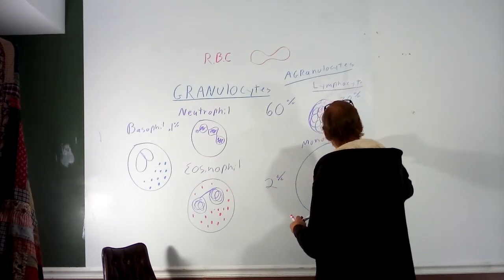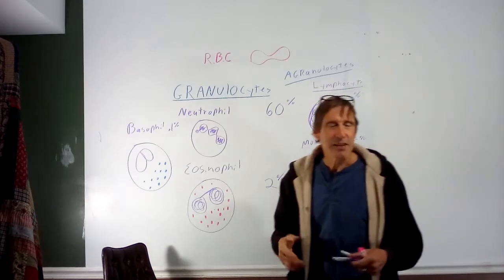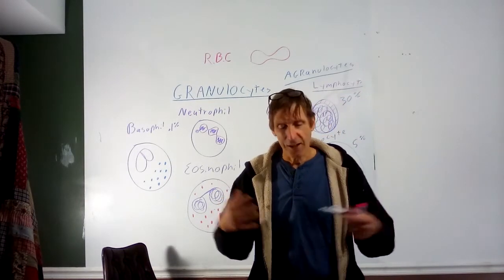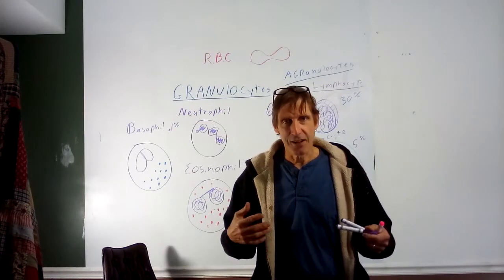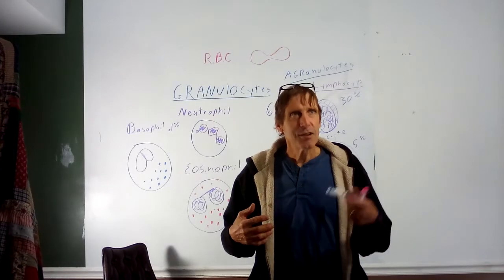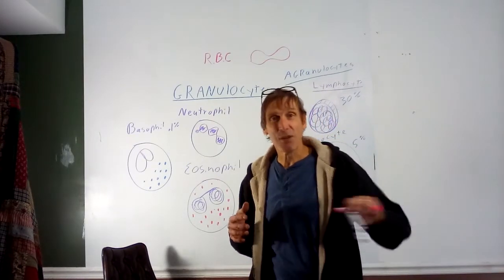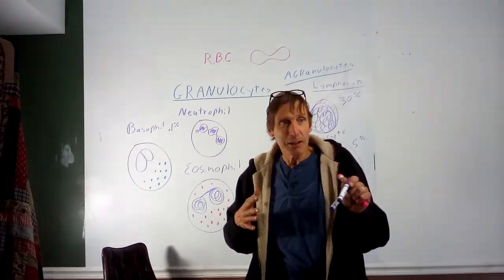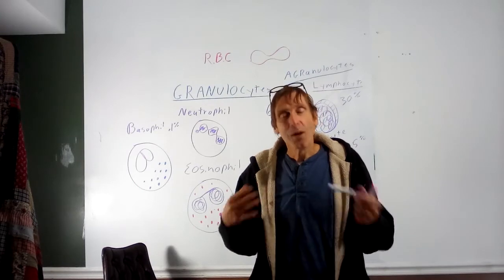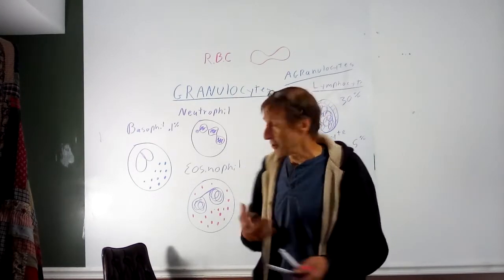They'll make up about 5% of the white blood cell volume. And it will tell you most of these white blood cells leave the circulatory system. Monocytes are phagocytic. That is, they engulf foreign material, bacteria, dead cells, that sort of thing. They tend to increase in number when you have a long-term or chronic infection, but most of their activity is actually when they leave the circulatory system. They can move like an amoeba, and they squeeze between the endothelial cells, or they'll move to a site of injury. Once they're out of the circulatory system, they call them macrophages, like what I mentioned in the lungs.